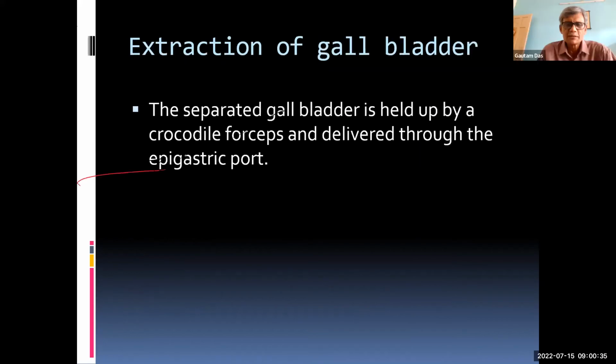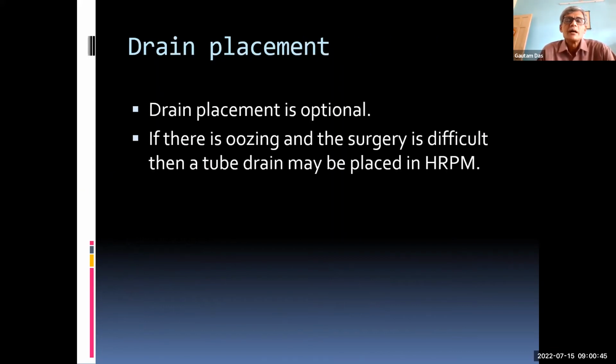So you have to wash it. Now you have removed the gallbladder. It can be removed also through the umbilical port. The drain is according to your option, whether your field is perfect and there is no spillage of bile at all, in which case you may not place the drain.